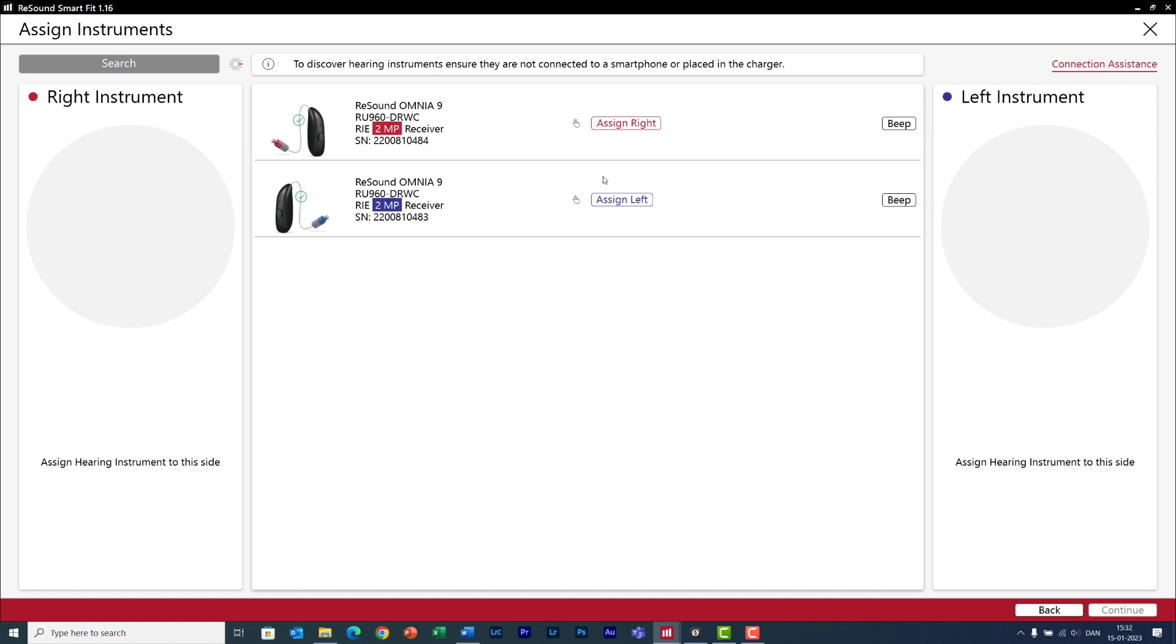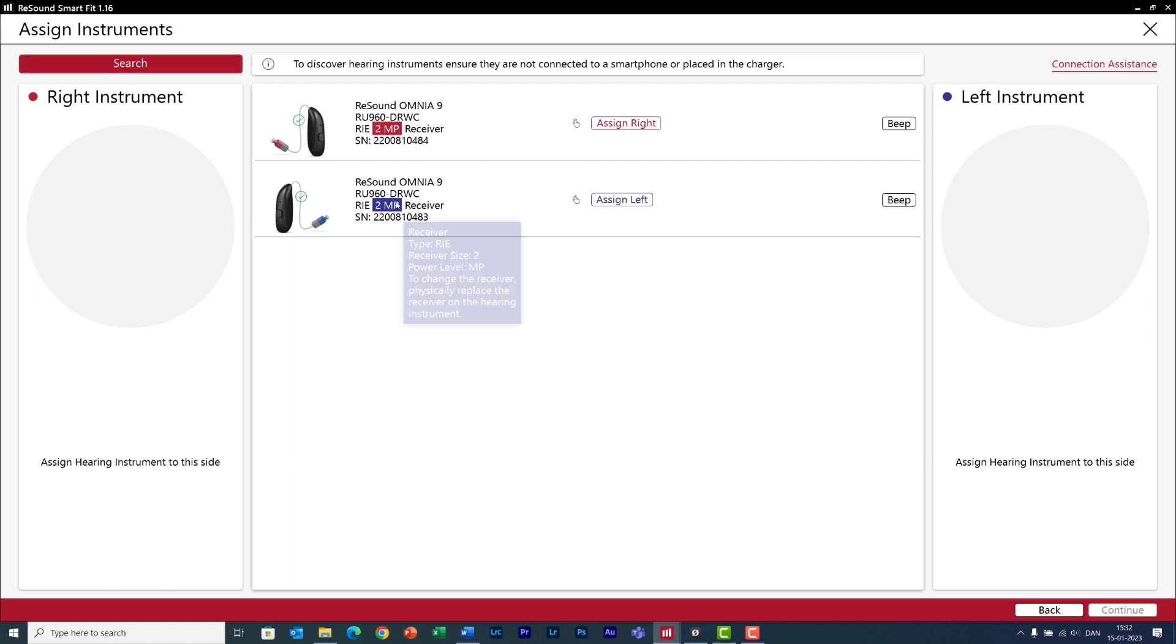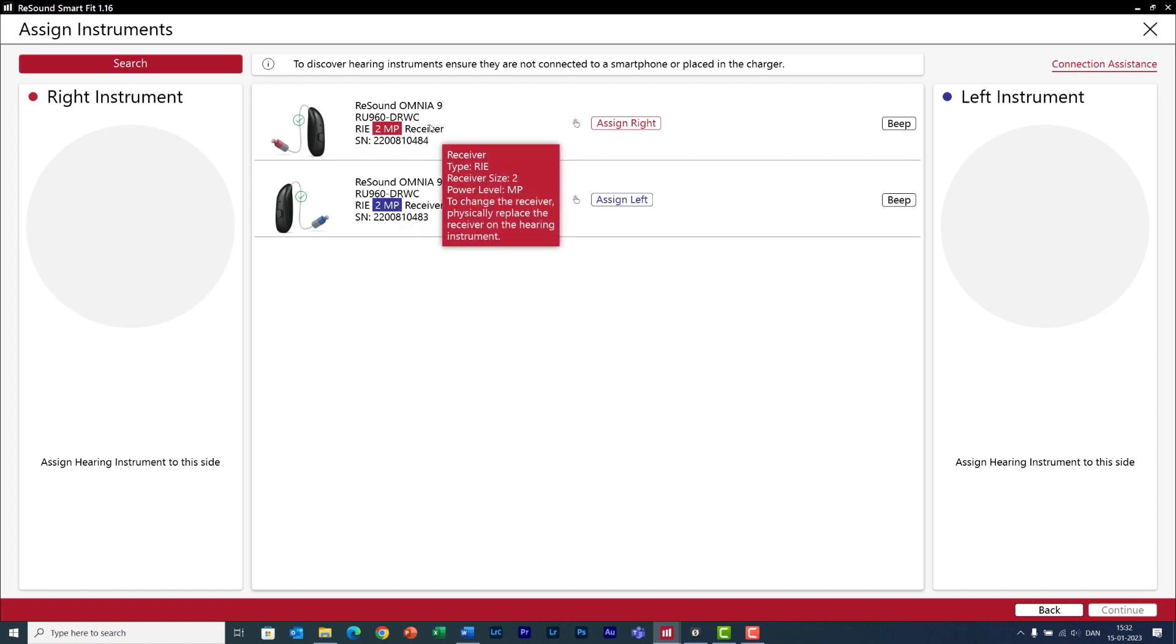On this panel you will see a list of all the hearing aids that are in range and these ones are mine. Now note how the software knows which one is for the left and for the right ear, and that's because we are using the SureFit 3 receivers.